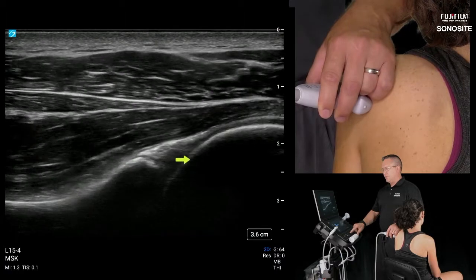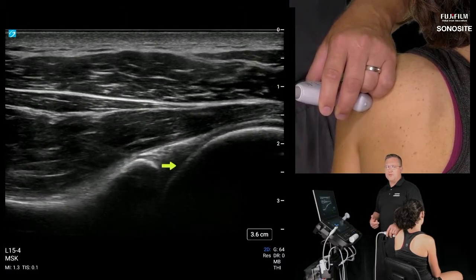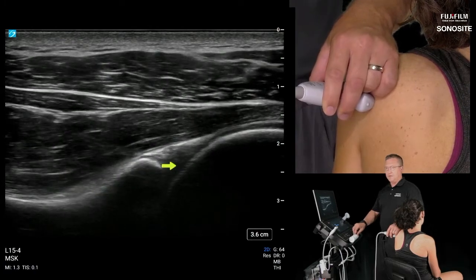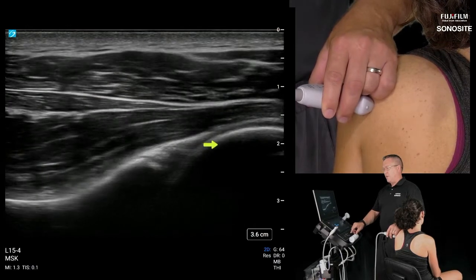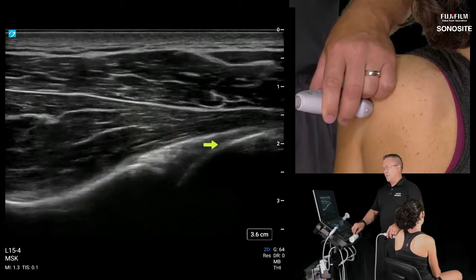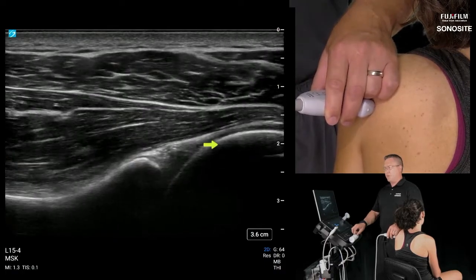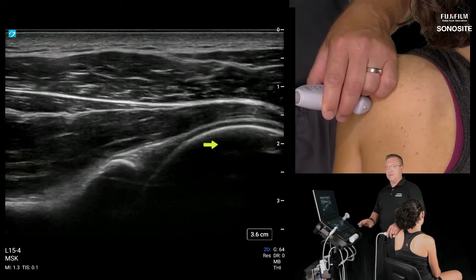Don't rely on ultrasound for anterior labrum. Don't rely on ultrasound for inferior or superior labrum. But posteriorly, if you see some pathology back here, you're probably not far off whatever the diagnosis is leading to. If you suspect labral pathology back here and you do maneuvers and everything looks normal, but the patient's clinical presentation is that they may have some sort of instability, or if your clinical exam is pointing to labral pathology, don't rule it out with ultrasound. You still need to rely on a standard MRI for labrum.